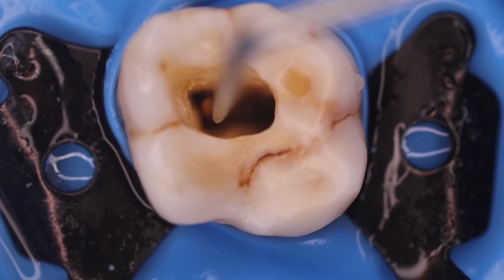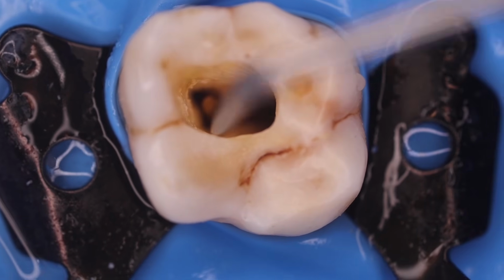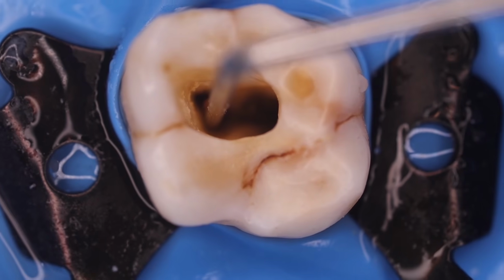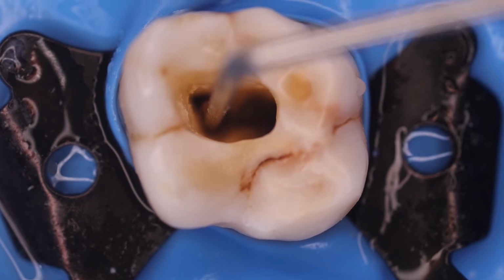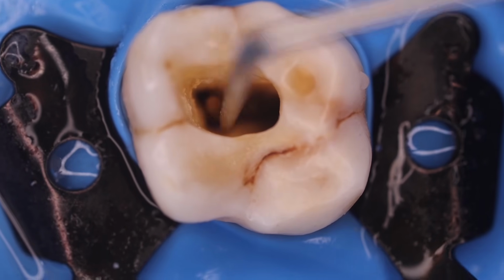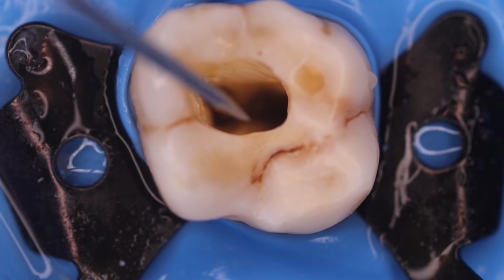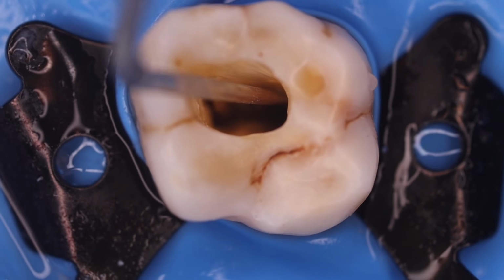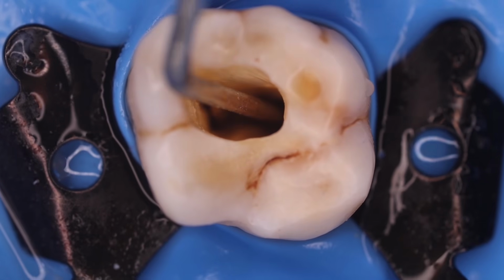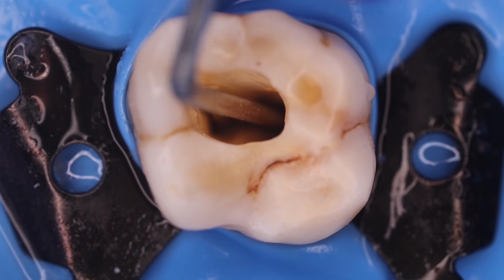Then coming to the distobuccal canal orifice, this is at the distal half of the tooth over here, as you can appreciate on the distobuccal aspect. This would be the distobuccal canal orifice. Our DG16 probe is engaging over here. Then coming to the last, this is the palatal canal orifice. The probe is engaging quite well over here, since this is a larger canal and easy to find.